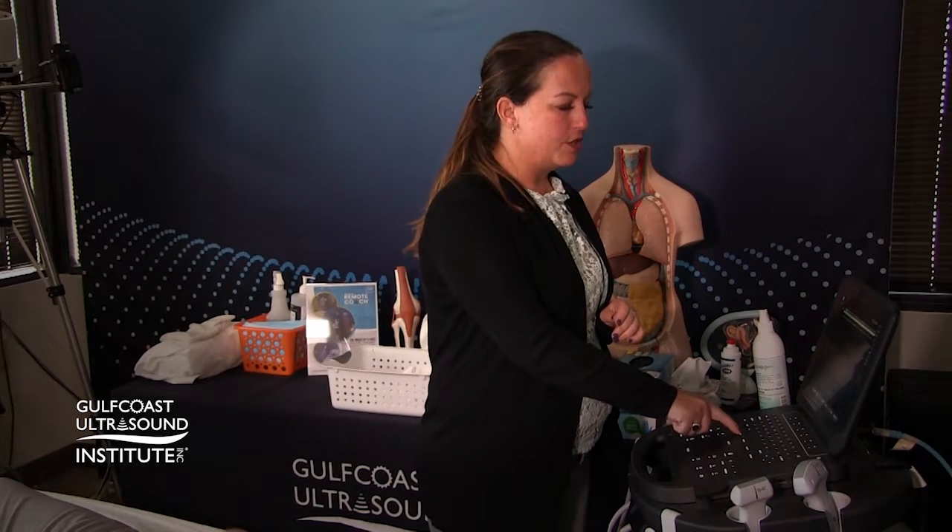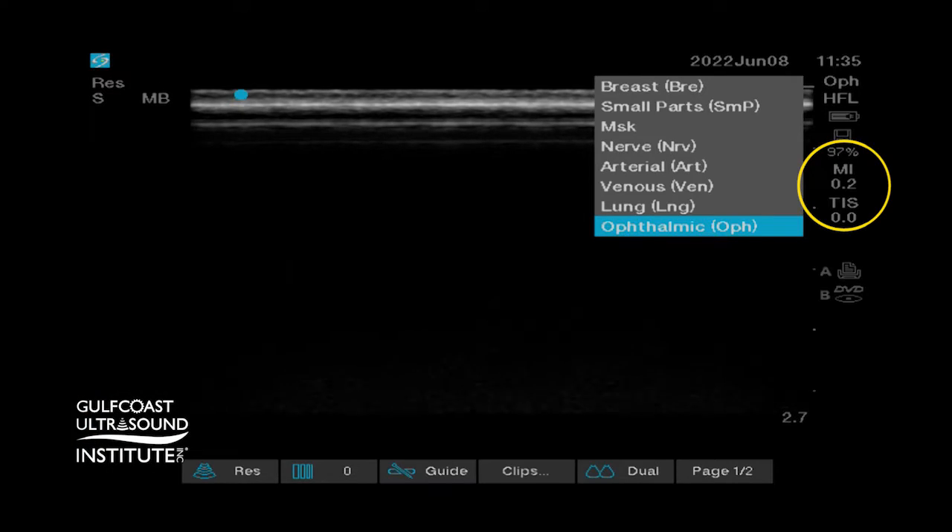One setting you can change on the machine to help decrease this risk is by going into the ophthalmic setting. You'll notice that the MI goes down to 0.2, which decreases the amount of energy directed toward the eye.